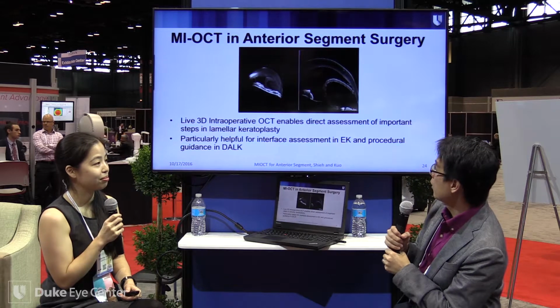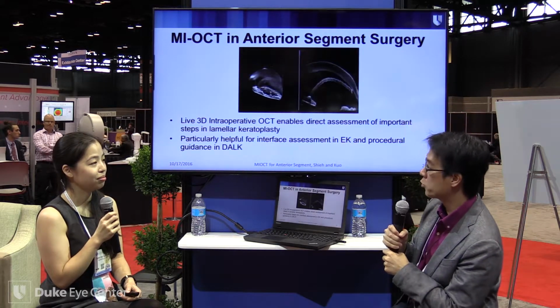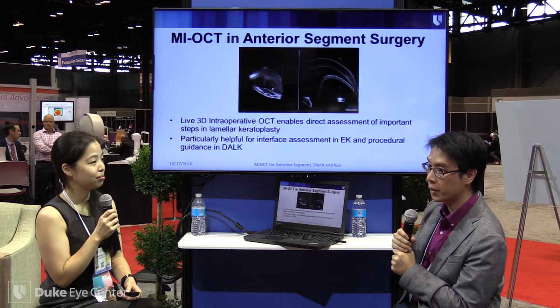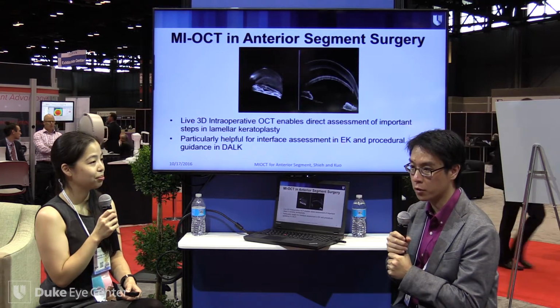Okay. So these now are just random cool videos that we're playing, but live 3D intraoperative OCT enables us to directly assess important steps in keratoplasty, and we think it's particularly helpful for interface assessment in endothelial keratoplasty and to help us do a lot of these more advanced corneal transplantations.